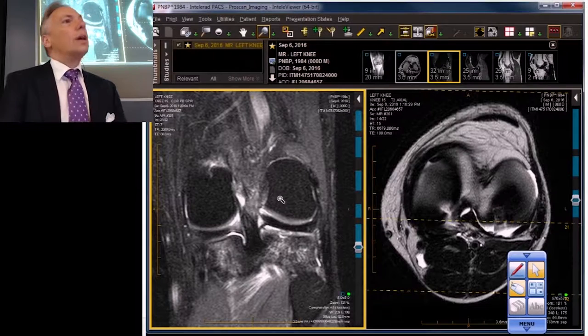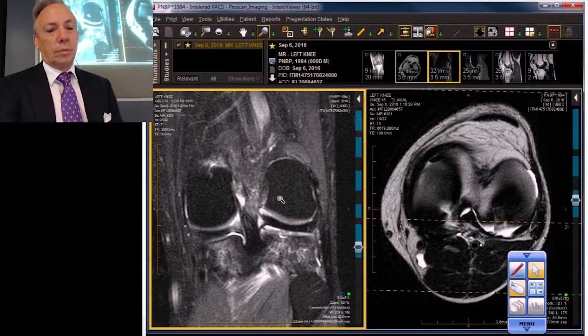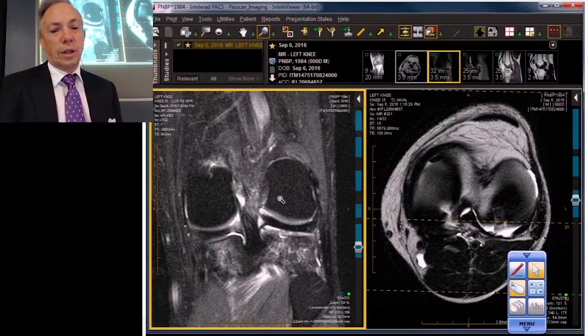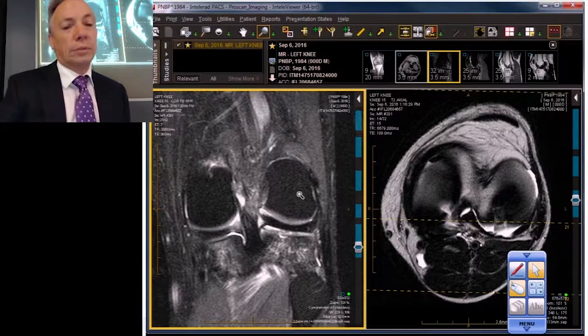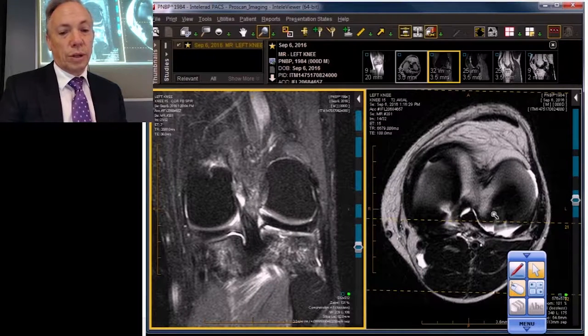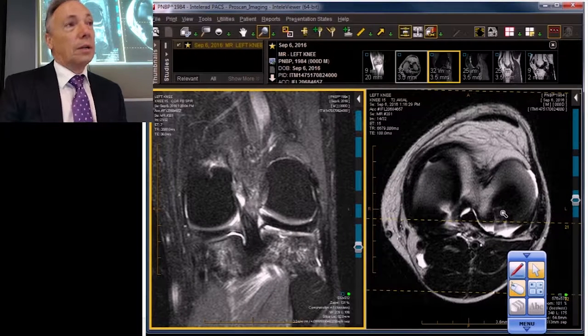This case is another meniscally focused case. It's an adult man with a work-related injury.